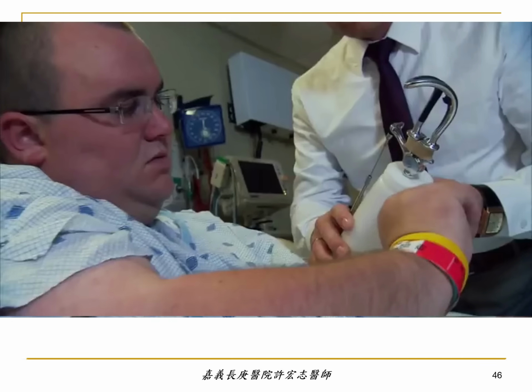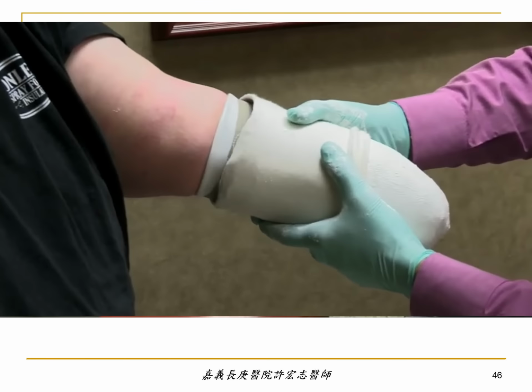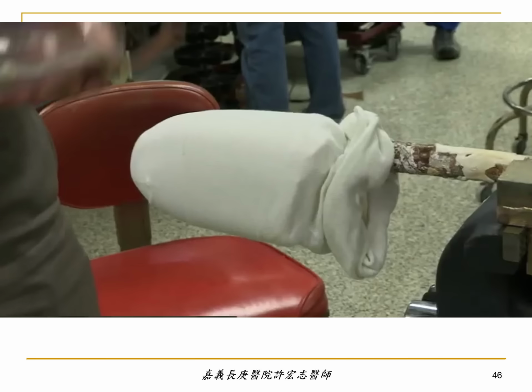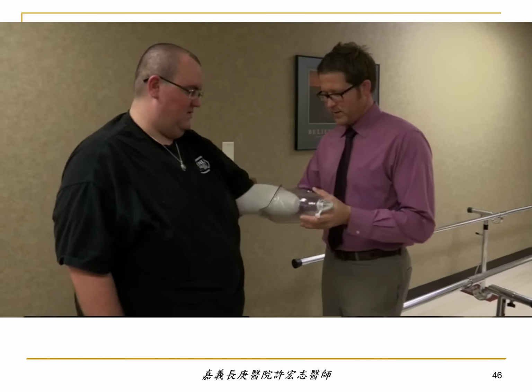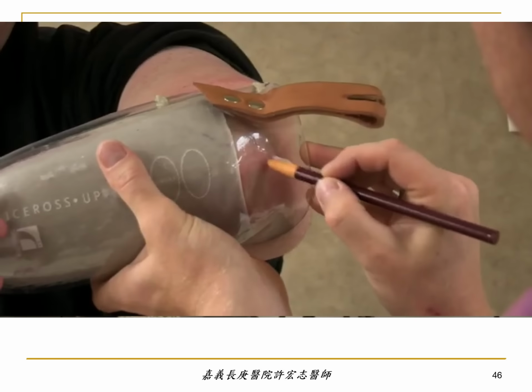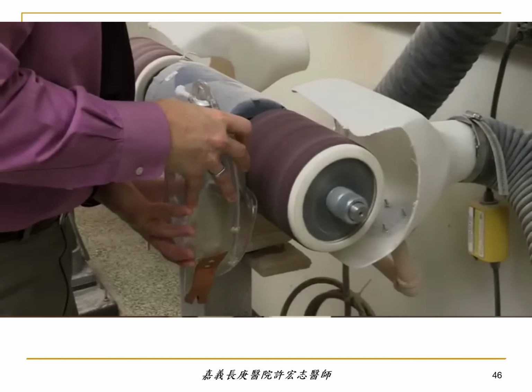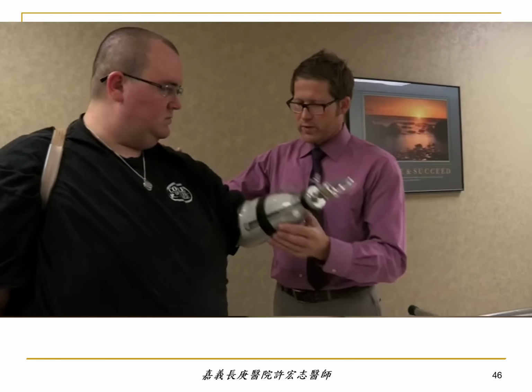The prosthetist is a very important person in the whole team. He took a casting of my residual limb and then used that to build my prosthesis. The prosthetist has to be with you all the way and say, how is it working for you? And if it's not working well for you, what can we do to make it work better? It takes some time, but it's well worth it.